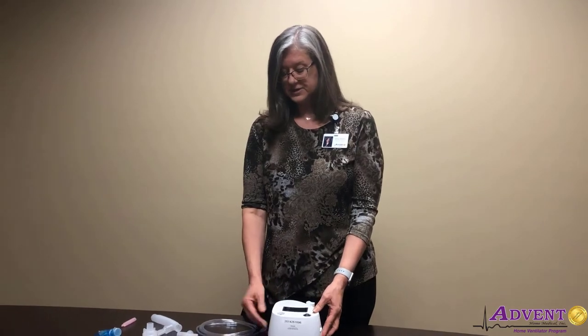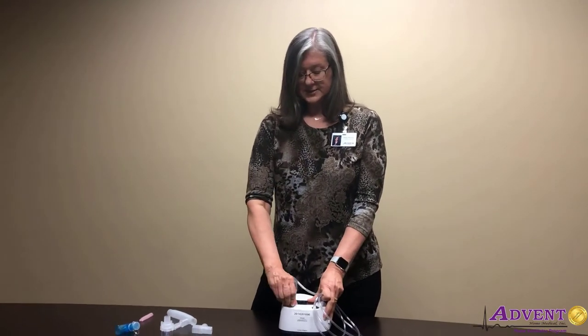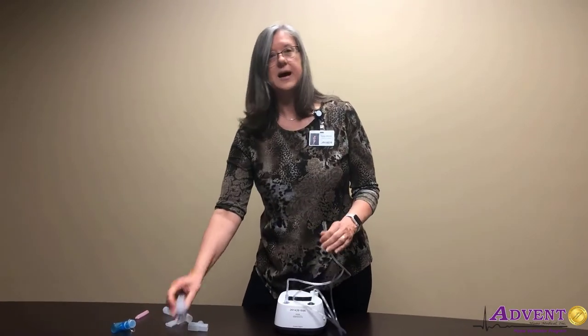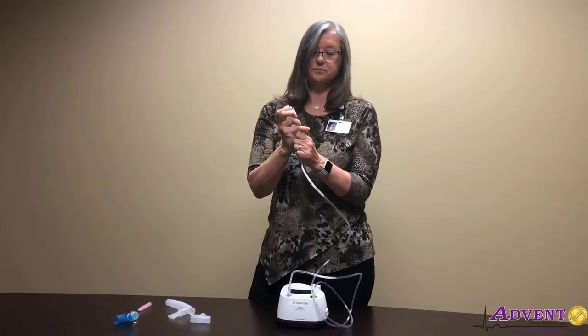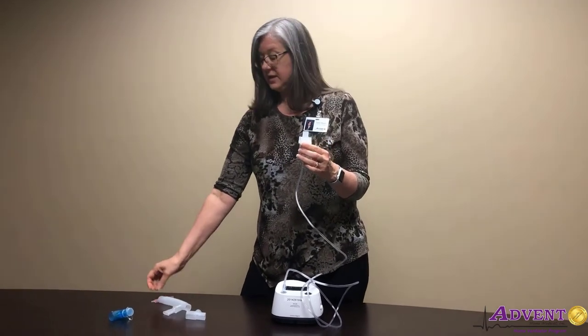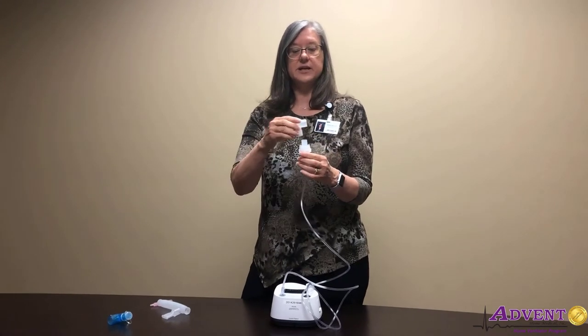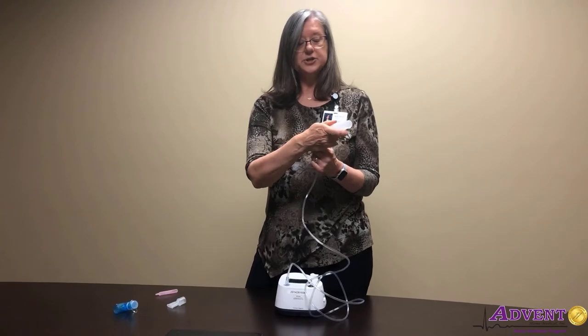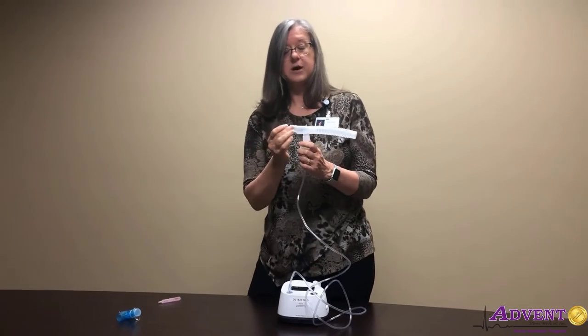We're going to give a nebulizer treatment. We want some air tubing and we're going to connect that to the air outlet of the nebulizer machine, and the other end will go to the bottom of our neb cup. We can take our medication and pour that in through the top. Then if we're going to do this non-invasively, we need a neb T, some corrugated tubing, and a mouthpiece.